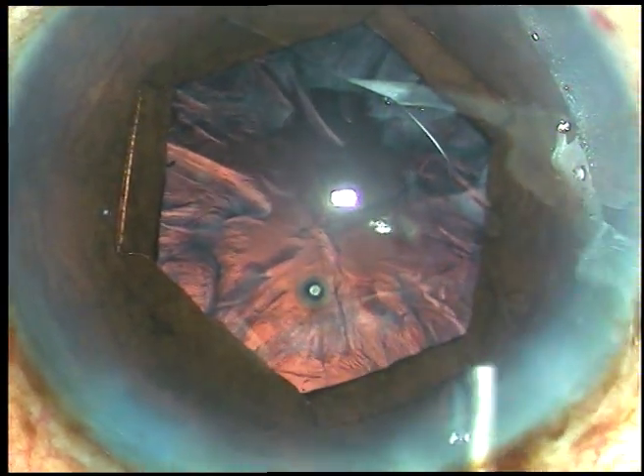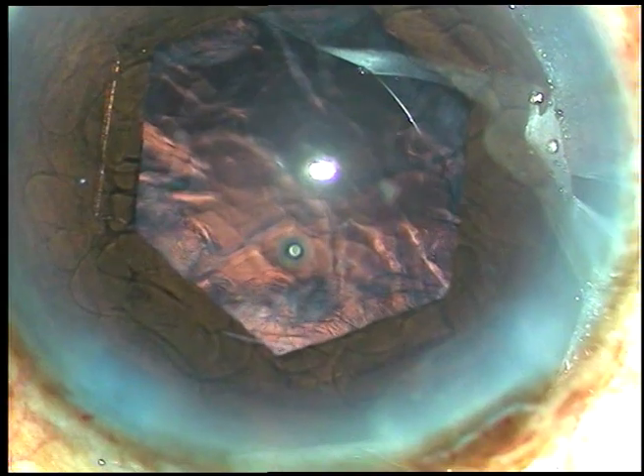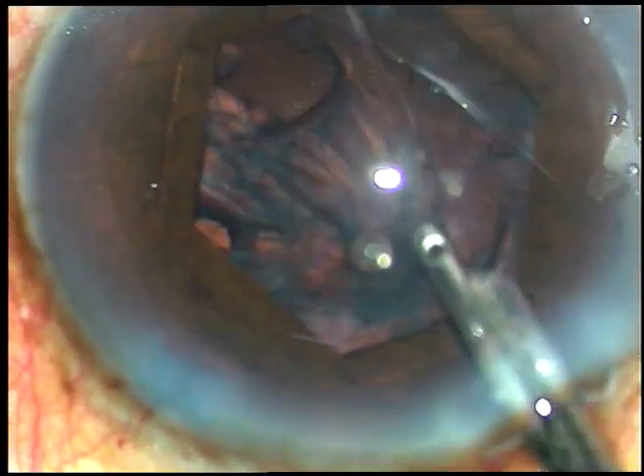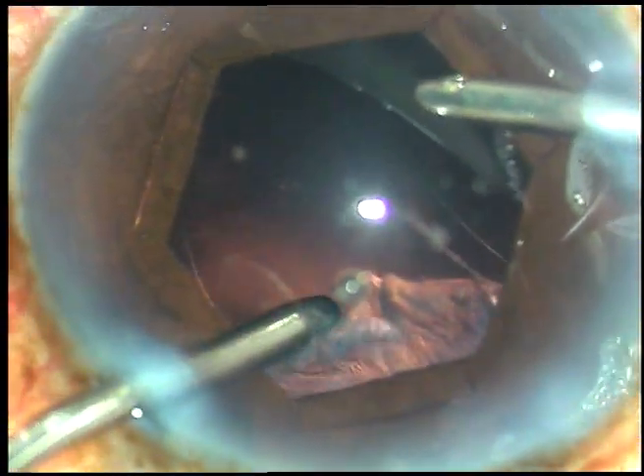There is a lot of cortex. What I am going to do is inject viscoelastic substance, and I will use Simcoe cannula to remove the cortical matter. After removing the cortex from the inferior aspect — say from 2 o'clock to 10 o'clock — I am going to use bimanual irrigation aspiration to remove the sub-incisional cortex.